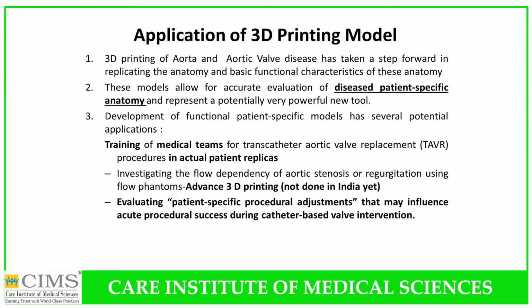Take-home messages. So this is one of the first cases in India and otherwise to use a 3D printing model, where we were able to evaluate the patient-specific anatomy in the diseased patient's case, and this helped train our assistant doctors as well as create a patient replica. We can use this even to look into the very minute details of the aortic valve and aortic stenosis. And we found that this was able to influence our acute procedural success.